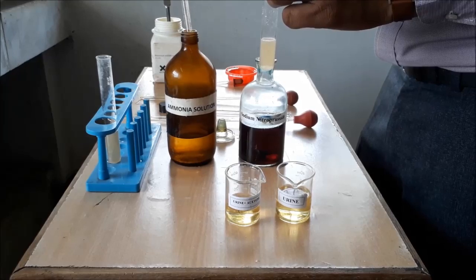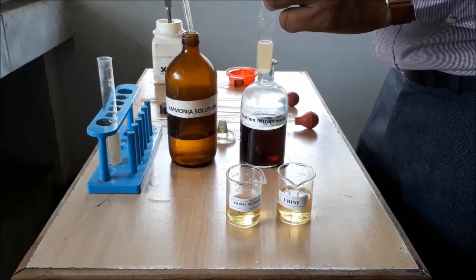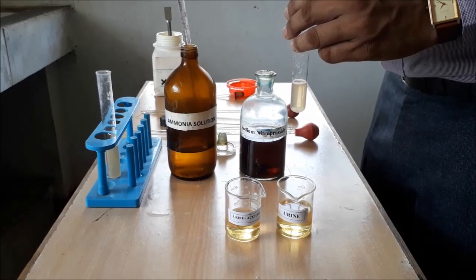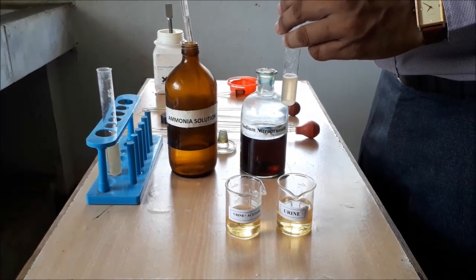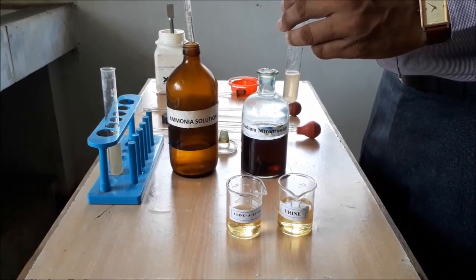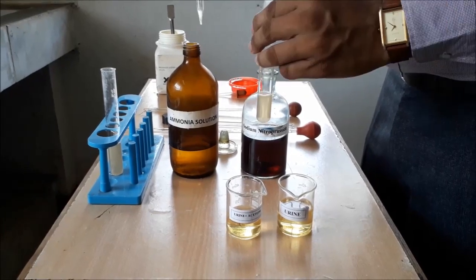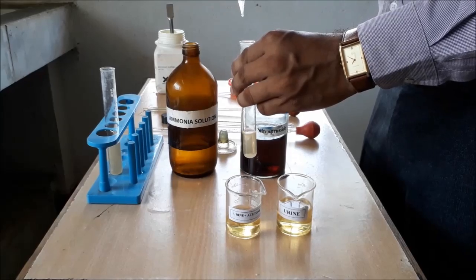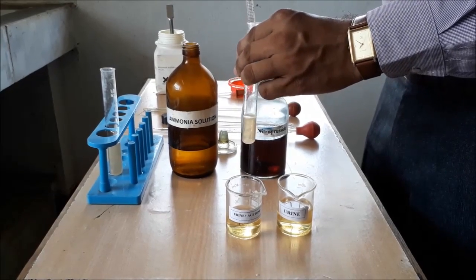Then, we have to add 2 ml of strong ammonia solution with the help of pipette from the wall of test tube. We are just adding 2 ml of the strong ammonia solution.